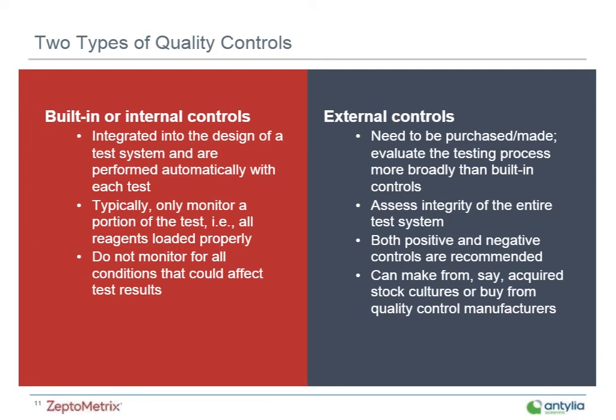But one chief part of a good quality management system includes process control. This refers to the control of the activities that are employed in the handling of samples and the examination processes in order to ensure accurate and reliable testing. All quality control processes fall under this process control term. And really the goal of quality control, and of using quality controls, is to detect, evaluate, and correct errors due to things like test system failures, environmental conditions, or operator performance before patient results are reported.